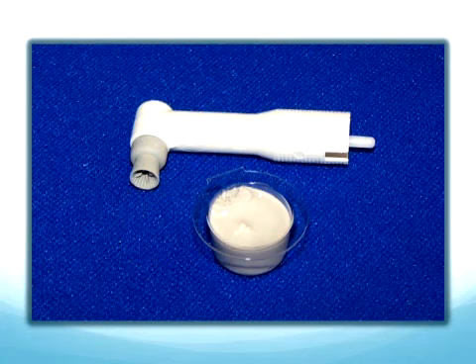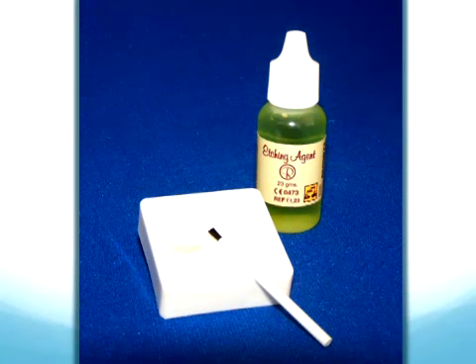First, a thorough prophylaxis using a rotary instrument. Rinse and dry. Acid etch with either phosphoric acid or a self-etching primer. If a self-etching primer is used, be sure to lightly dry at the conclusion.